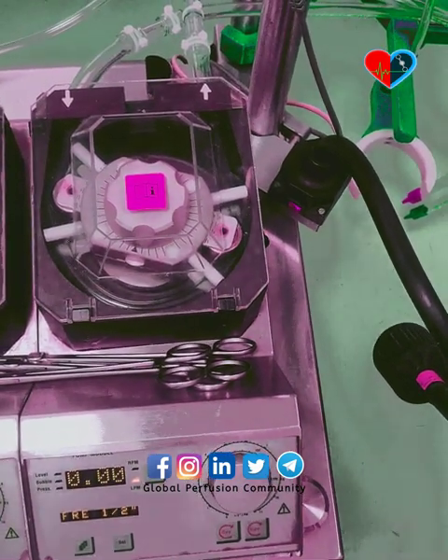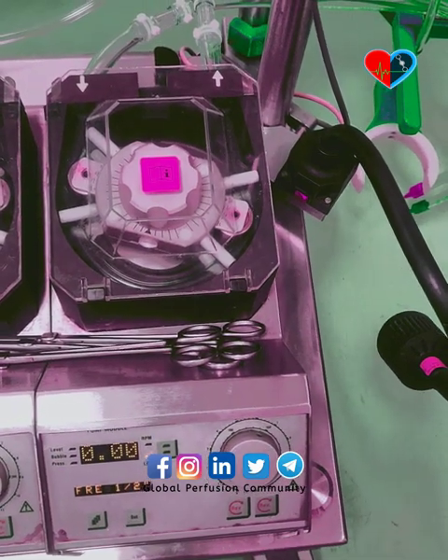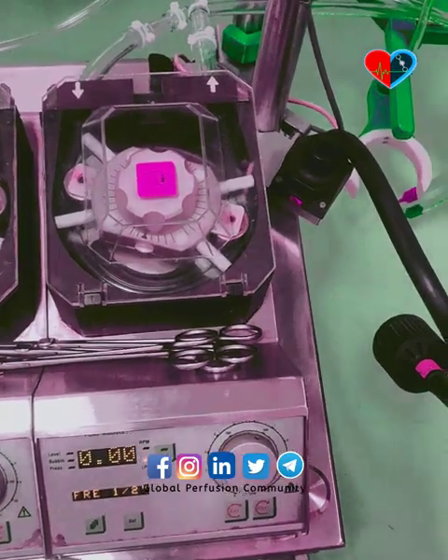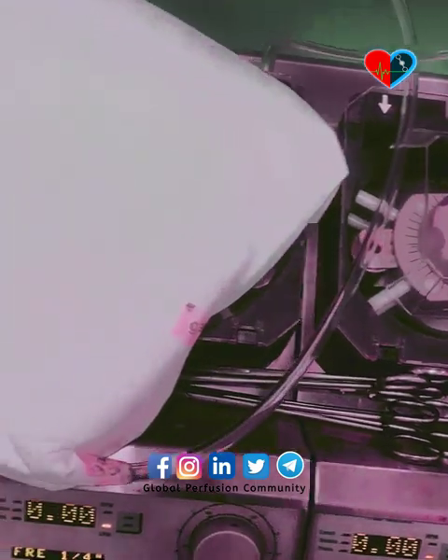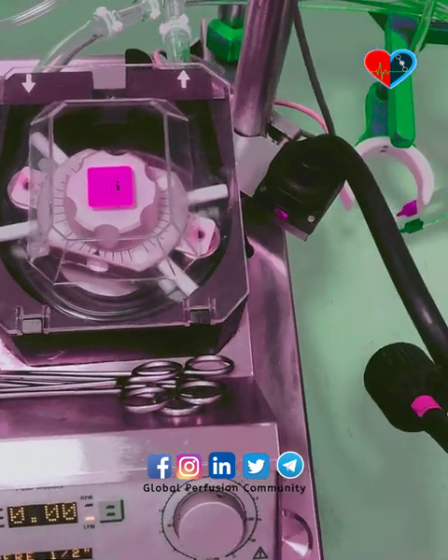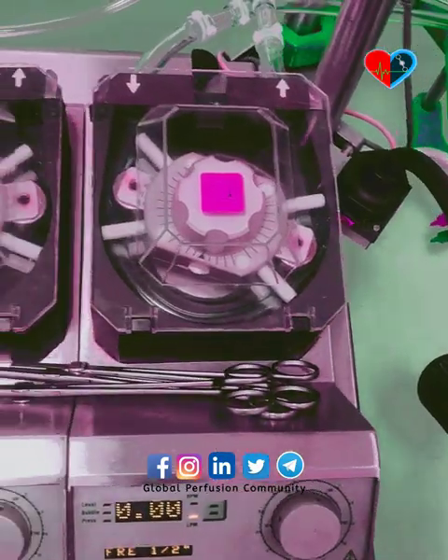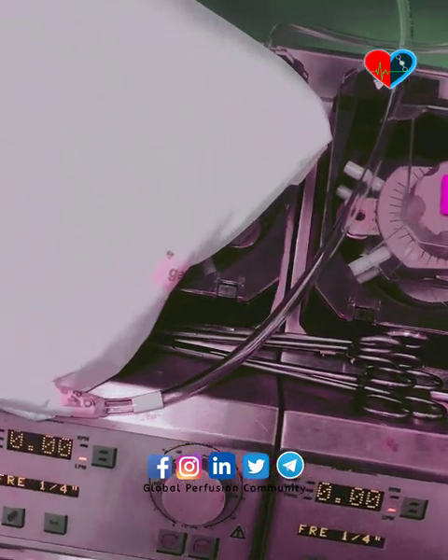Hello guys, welcome to Global Perfusion Community. A perfusionist operates this heart-lung machine. As you can see, it has four modules and four pumps usually, and sometimes this machine can also have five pumps. Each pump has its own use, and this is a demo setup.